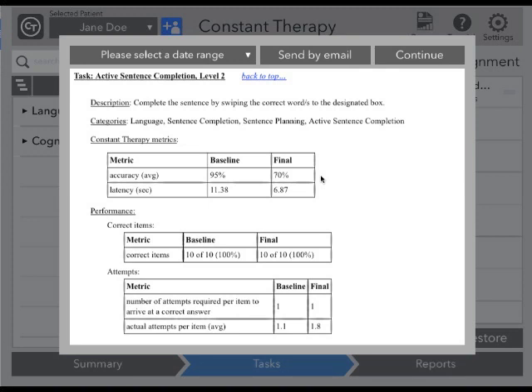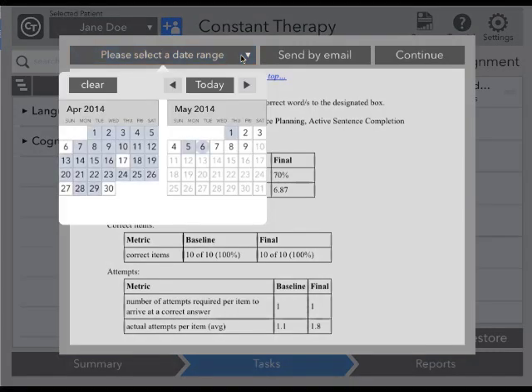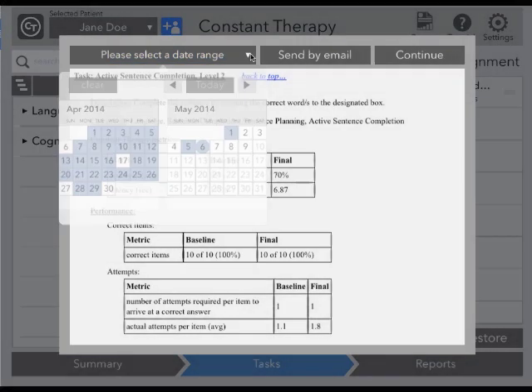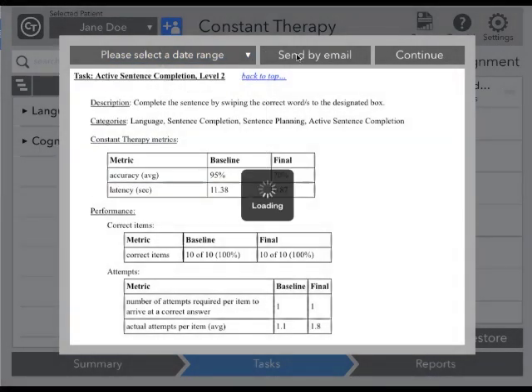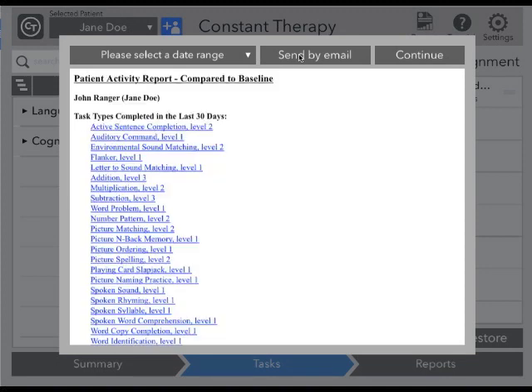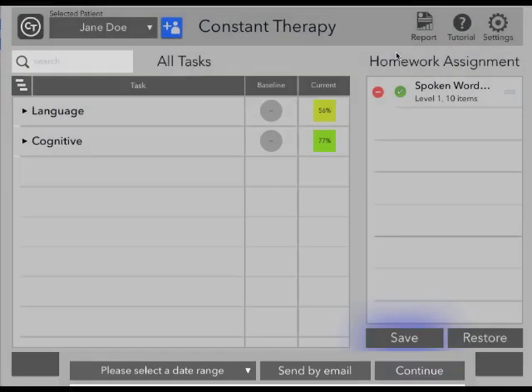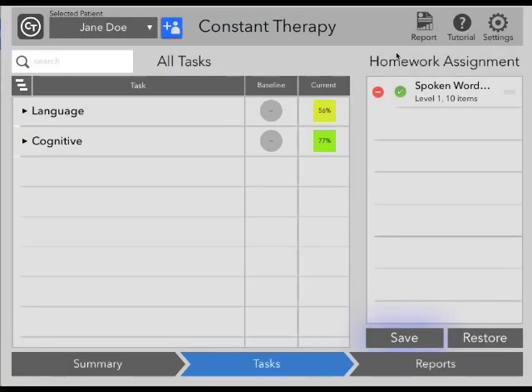Each report contains information about the patient's baseline score and final score. You can tailor the report to a specific date range by tapping Select a Date Range, and you can also choose to send a report by email.